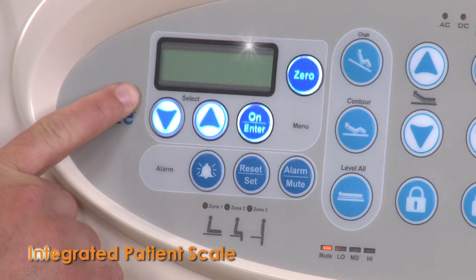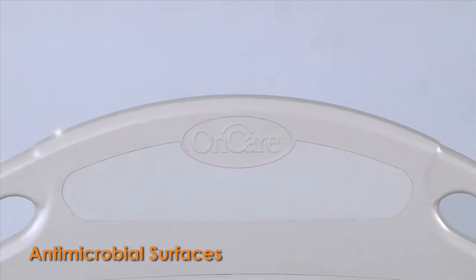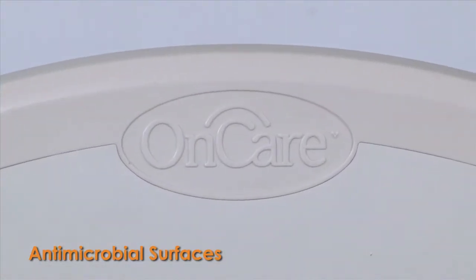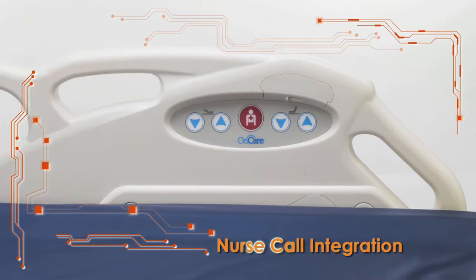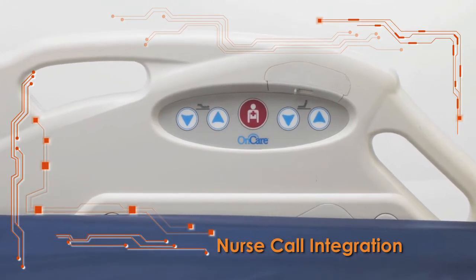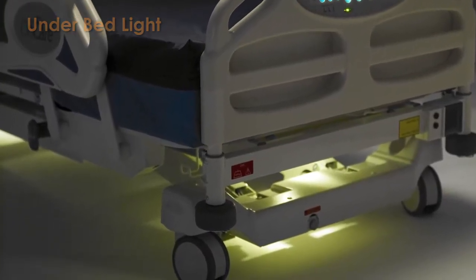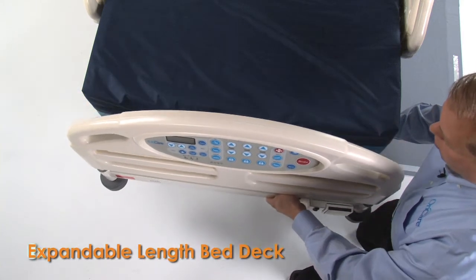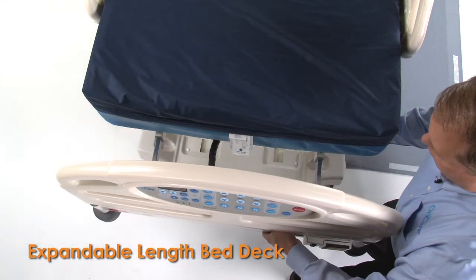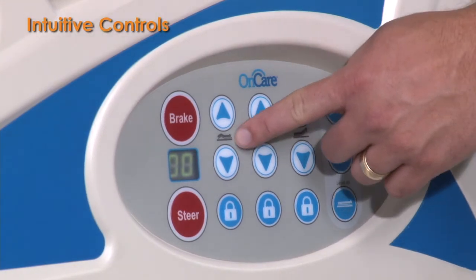An integrated patient scale makes weighing patients quick and easy. Antimicrobial surfaces support your facility's infection control initiatives. Nurse call integration alerts caregivers to patient assistance needs or when bed exit alarms are activated. The Harmony's under-bed light supports safe patient egress. An expandable length bed deck accommodates the tallest patients, and logical, intuitive controls let caregivers focus on patient care.